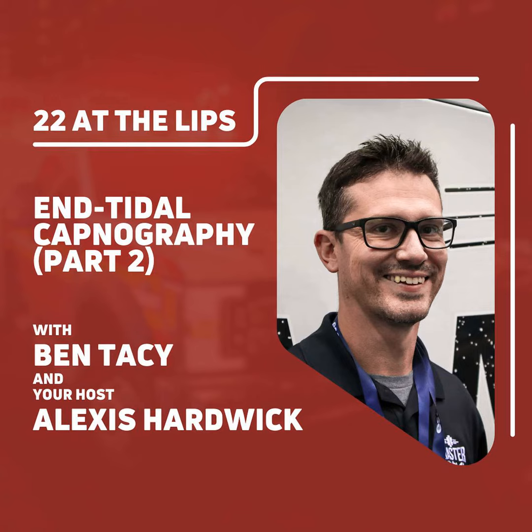So yeah, a very excellent diagnostic tool. Like every place that has sepsis protocols or standards, that's the big thing: trying to get axillary, oral, or rectal temperatures, and what is their end-tidal reading? Then, boom, if you are fevered with a low end-tidal, you have sepsis, and you're going to treat it accordingly.